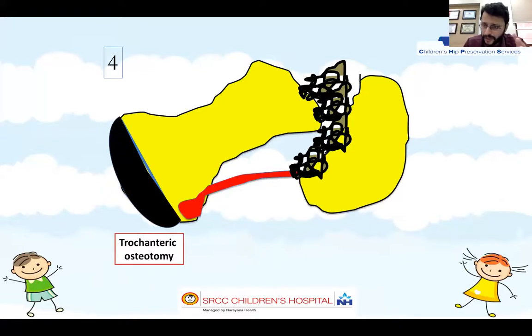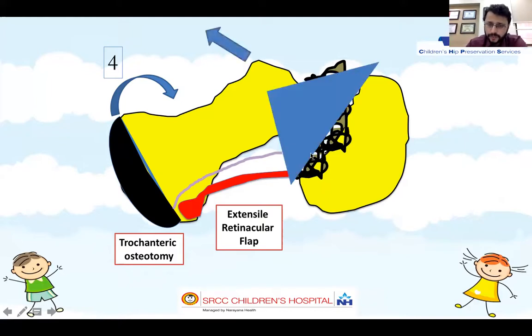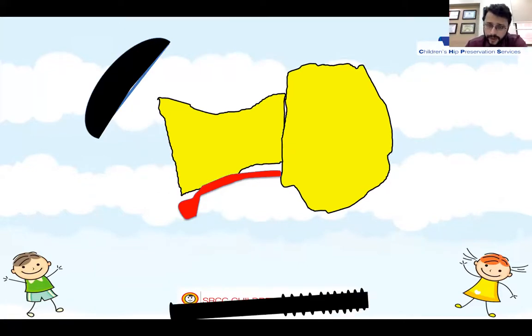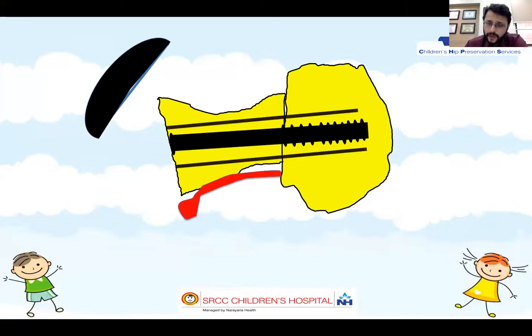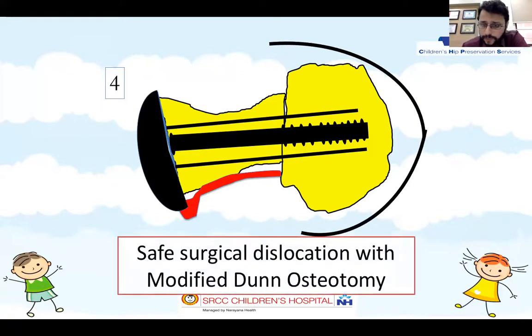I'm going to describe this in detail, but just conceptually, it is a trochanteric osteotomy, where you flip the trochanter anteriorly, you dislocate the head anteriorly, create an extensile retinacular flap so as to free this entire femoral head, remove the callus from anterior as well as posterior, shorten the neck slightly, reduce the femoral head, and fix it with one screw and two wires or two screws, and fix the trochanter.